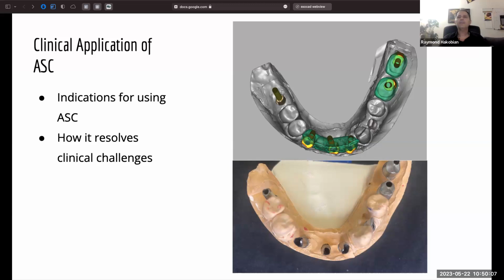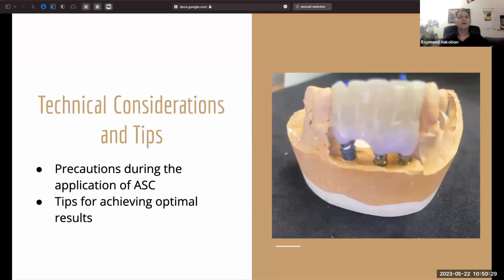Let me see, there's a picture. Yeah, this case actually, the patient lost a lot of bone. We're using like 30 millimeters of zirconia, and actually it was a facing. It wasn't a full zirconia restoration. If you see it, there's a lot of height on the zirconia.